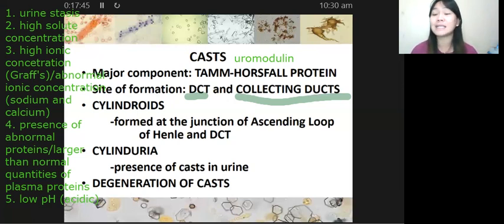So, hindi talaga pwede dito yung prolonged standing urine. Because remember, what is the effect if you are going to stand your urine sample for prolonged periods of time in the laboratory? Magiging alkaline yung pH. At pag naging alkaline yung pH or even pag naging neutral yung pH ng ating urine, mawawala yung ating casts. Ano ba ang gusto ng cast when it comes to the pH? Acidic. Okay, low pH, acidic. Nakuha? Alright, ayan. Very good.